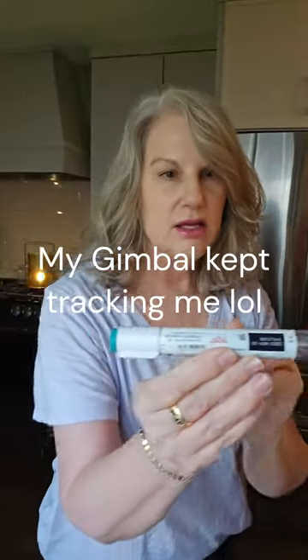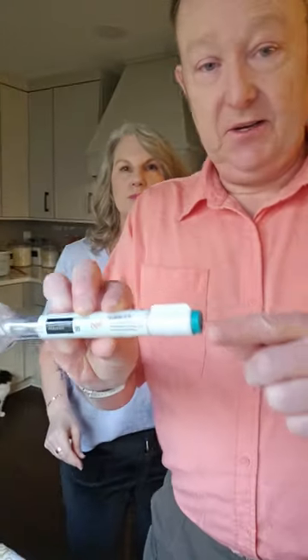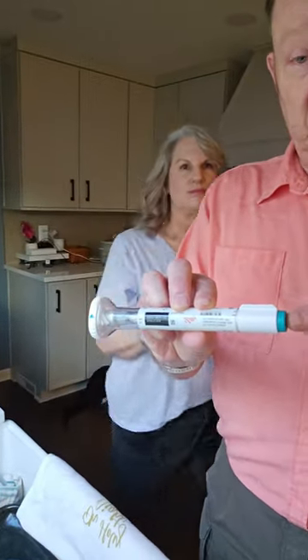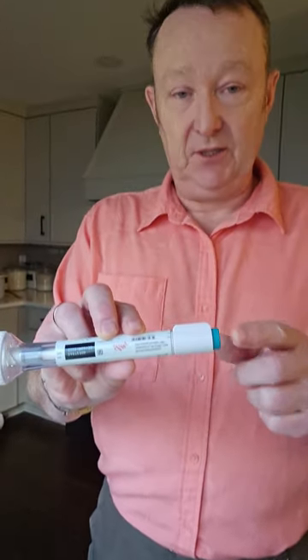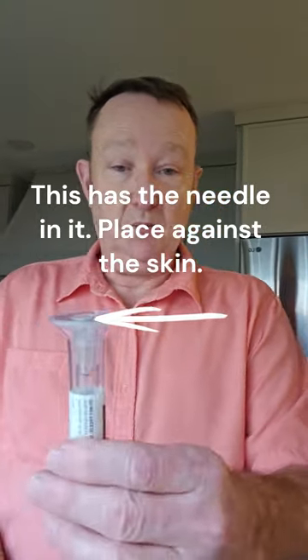Husband? Okay, he's going to explain this part about unlocking it, what it looks like. So this is the device. This is the end that you press the button to do the actual injection. There's a safety switch on here with a locked and an unlocked button. And then this, you turn and pull off like that.